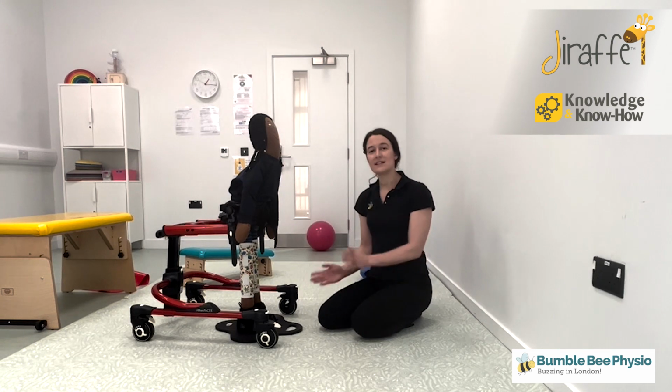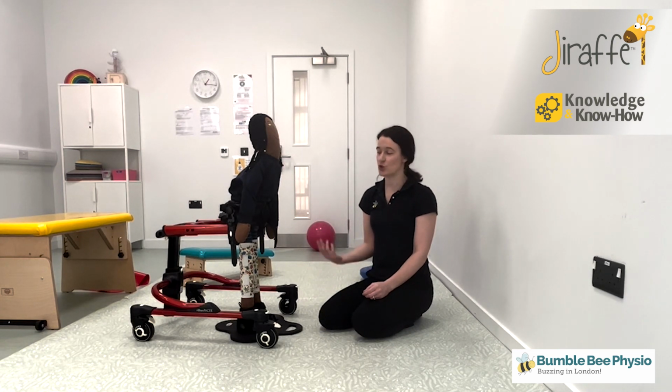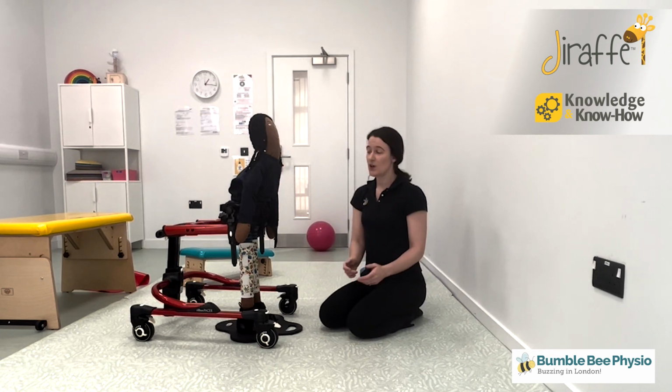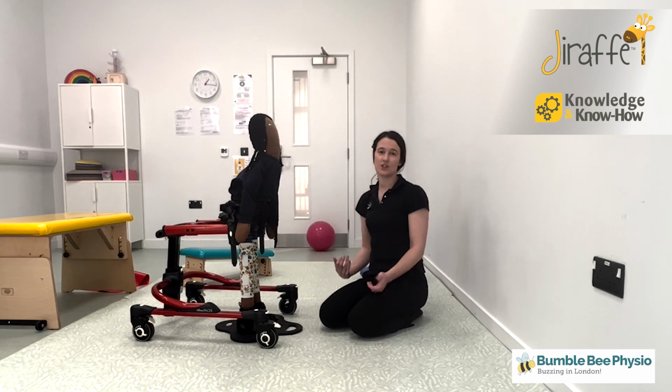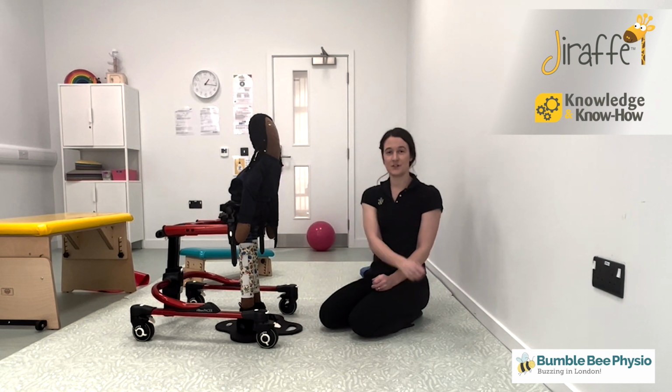Another way to isolate each hamstring: you think about the hamstrings, they're made up of three muscles and not just one. There's a lateral, a medial, and a middle one. So to isolate the different ones, you can do reaching in different directions. So you might want to reach with the right hand over to the left and down, and vice versa.